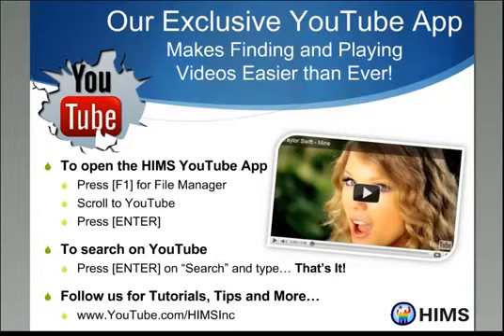Loading. And we'll go ahead in just a moment. We will hear the sound of a Blaze EZ turning on, which is a digital book reader. And then you will hear Jenny Axler, who works in our international office, start to talk to you about the Blaze EZ. Blaze EZ Unboxing.